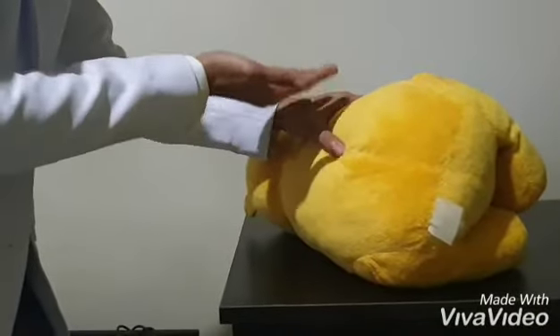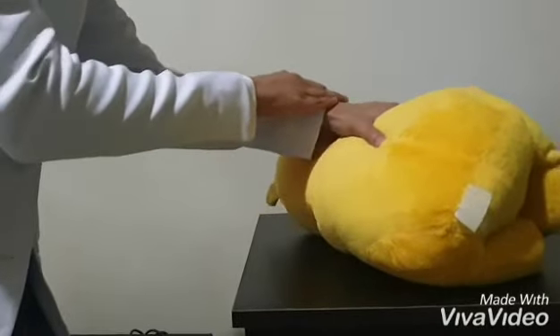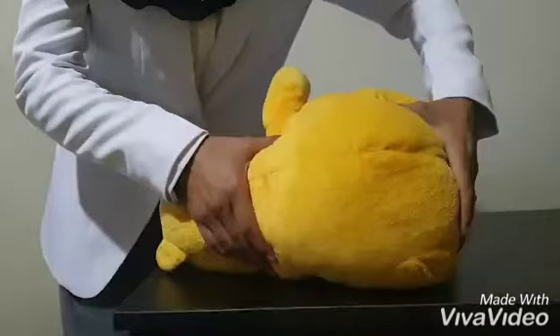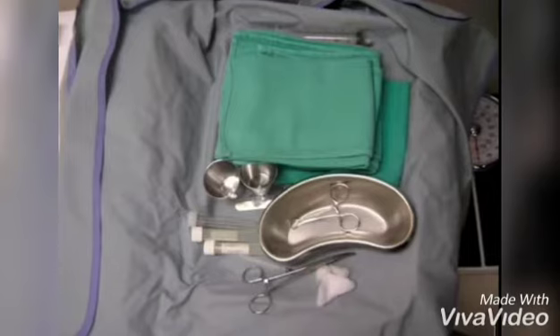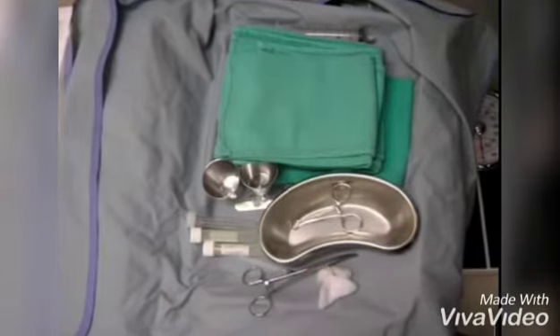It might be helpful to hold the finger of your non-dominant hand at the space to mark the spot. This will also allow you to feel if the child is rotating away from you. A sterile environment is a must. You should wear your gown, gloves, and mask.